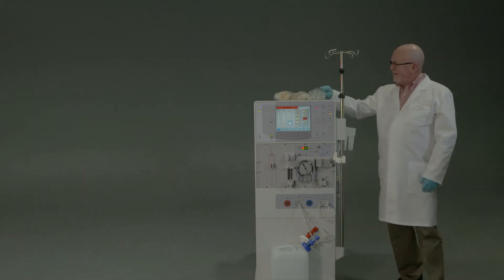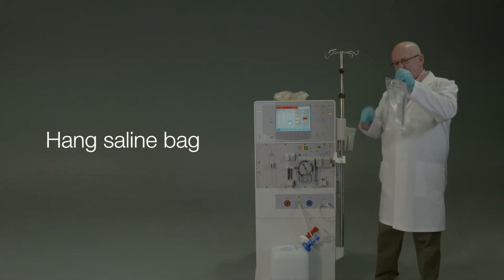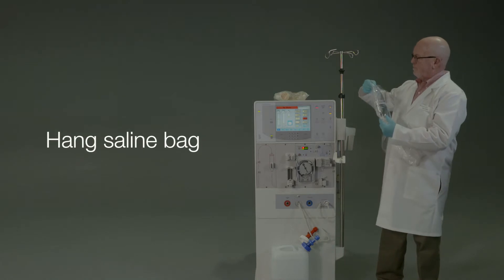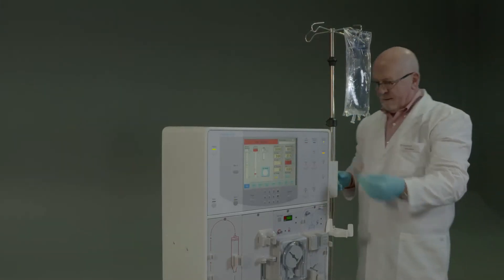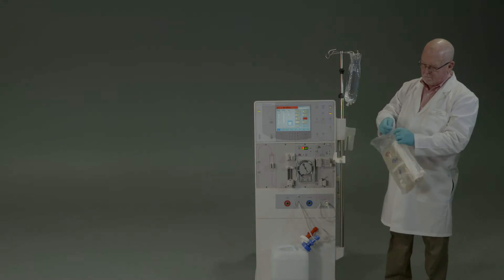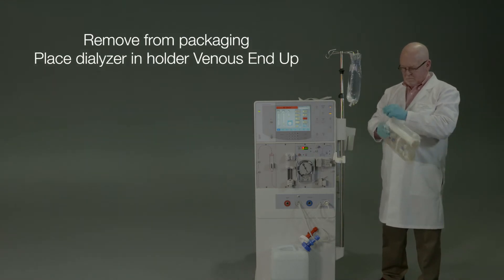Now we'll demonstrate setup of Streamline Express and priming of the blood circuit. Begin by hanging a saline bag on the machine's IV pole hook.